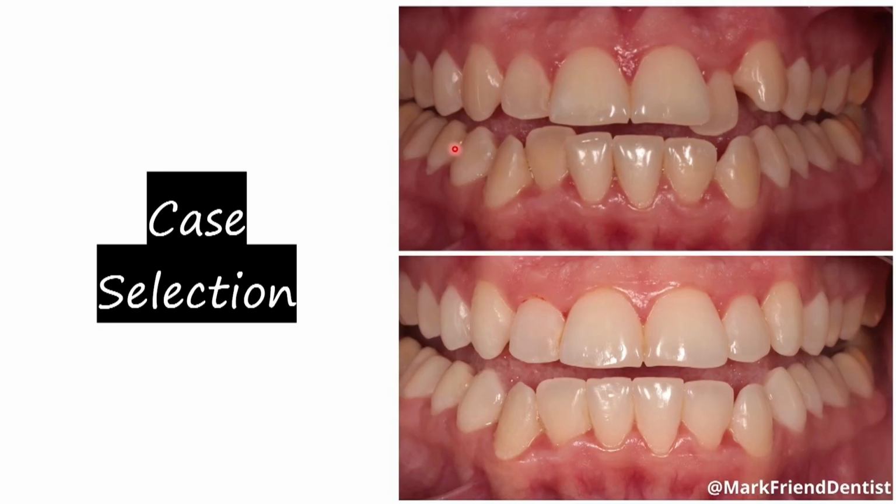I would look at this case in front of us today, and this was a case that I treated. And in reality, I actually would call this a moderate case. Some might call it simple, and we wouldn't criticize them for that. The reason I will call this moderate though is because we do have this anterior crossbite there, and crossbites do tend to be a little bit harder to fix, and so that just puts it slightly out of simple for my liking, particularly if you were a general dental practitioner.